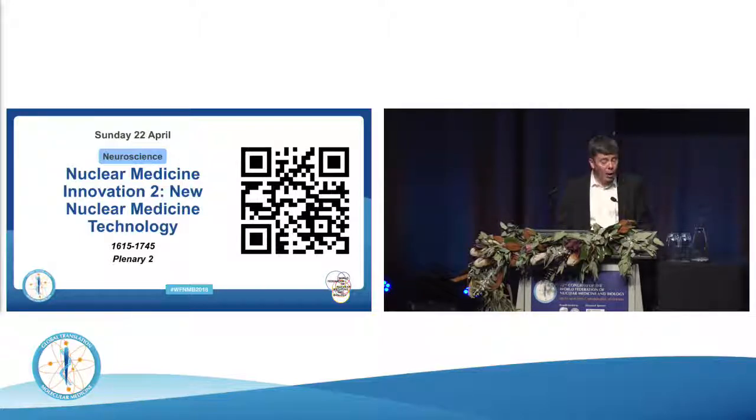So, but we will have the capacity, at least for research applications, to pull all the data off the scanner and process it. And so it's only if we want to do real-time coincidence formation for more standard clinical applications that we would throw some of that data away. And we're really not throwing very much away. It's only the very most oblique lines of response where the attenuation through the subject is very high, the scatter fraction is really high, and so those lines are not really adding that much information.